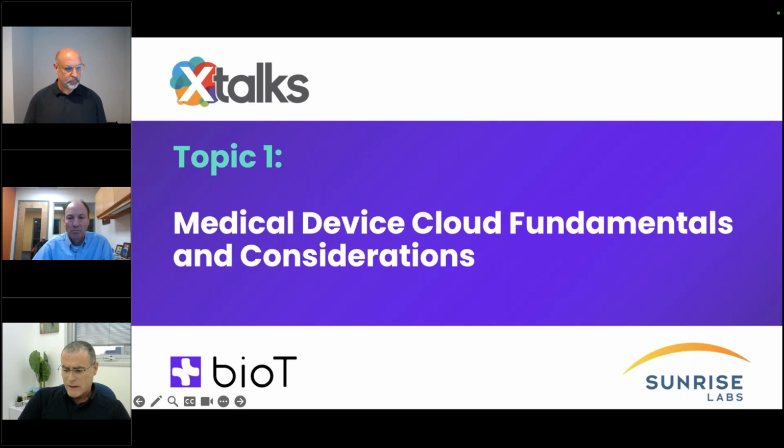Two more examples. One company is called Zilia, from Canada. They are doing retina image analysis. Also here, because the images are quite heavy, video and stills, offloading them to the cloud and then running GPUs from NVIDIA or others to process them is more efficient, dramatically reduces cost on the device side, and makes the device easier to develop and manage.